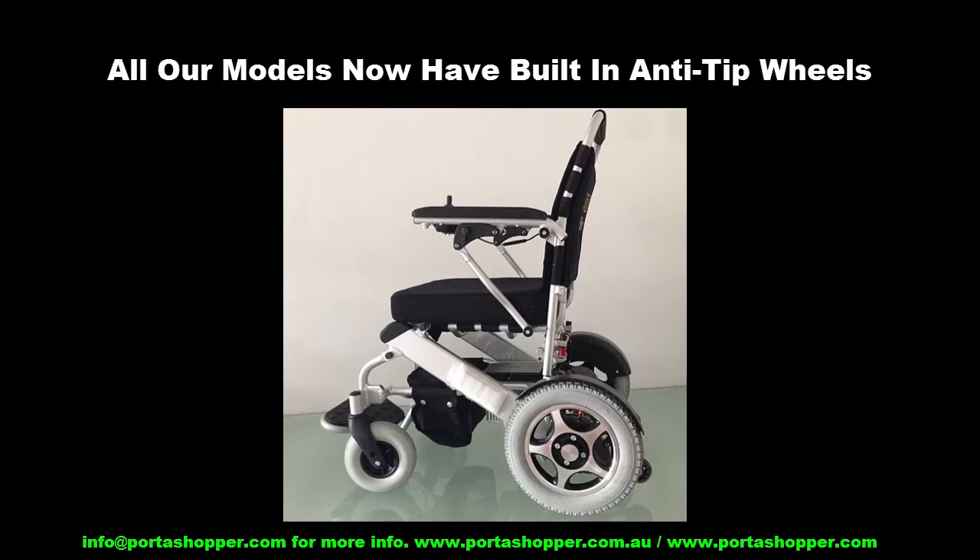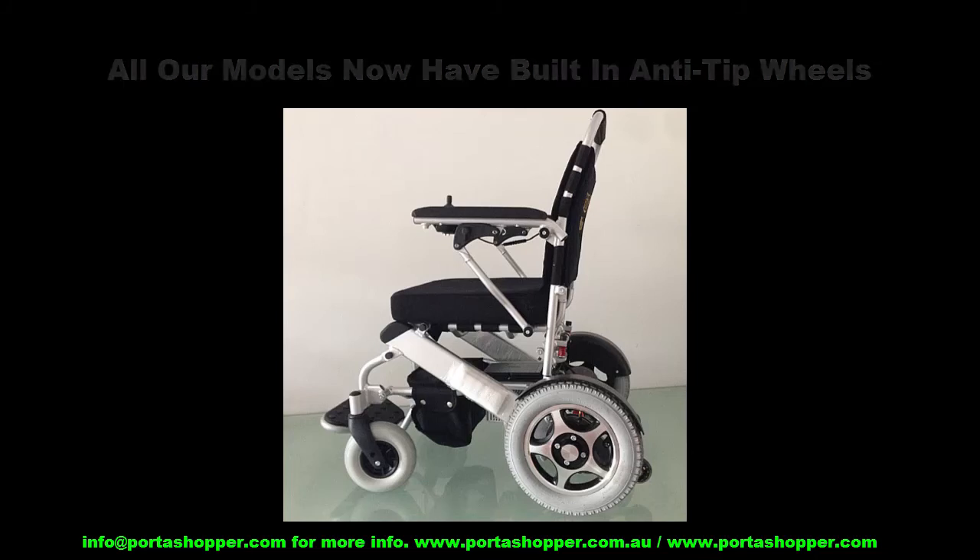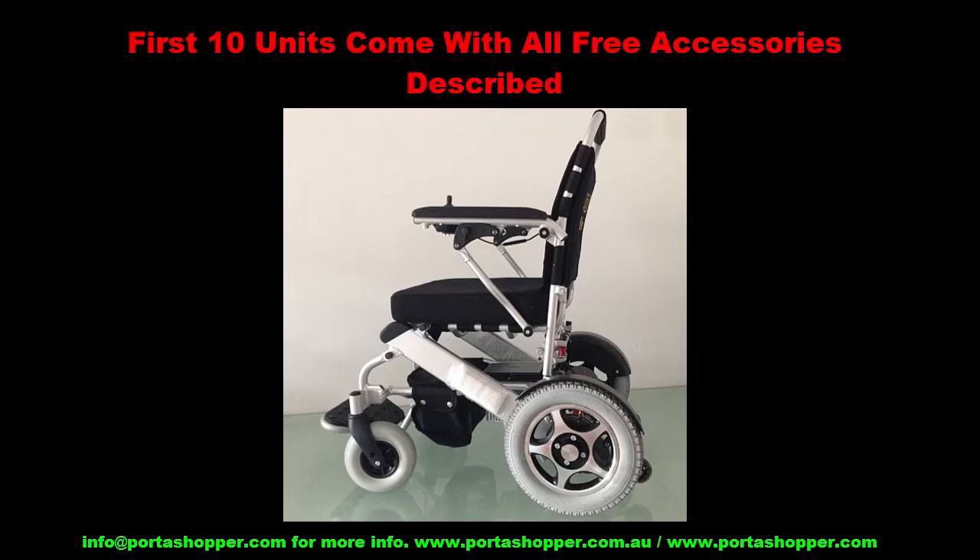These are now the PortaShopper Grand MK3 with 10-inch solid wheels and the PortaShopper Super Grand MK3 with 13-inch pneumatic wheels. These are also shipping with all the free extras for the first 10 units, so hurry before they're gone. Thank you.